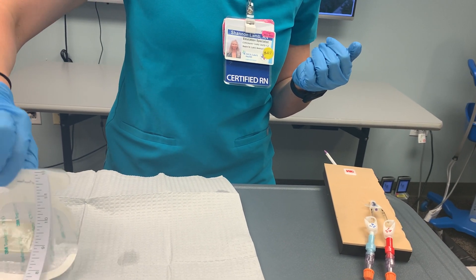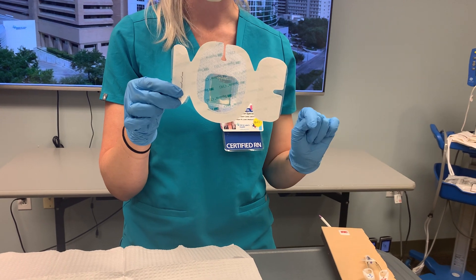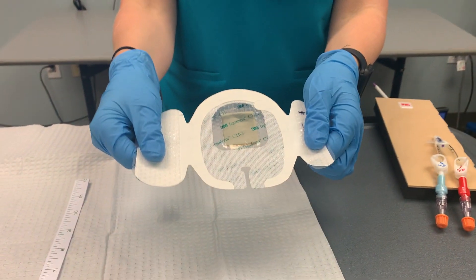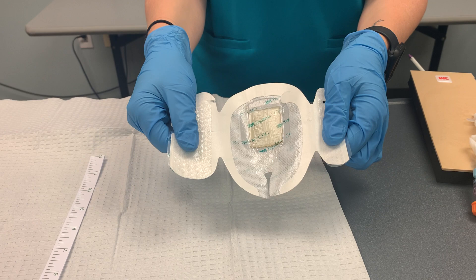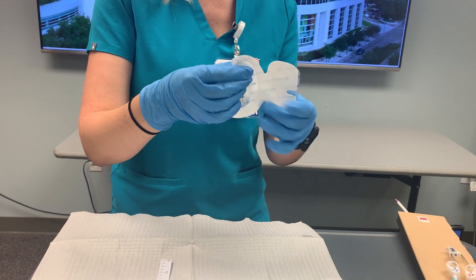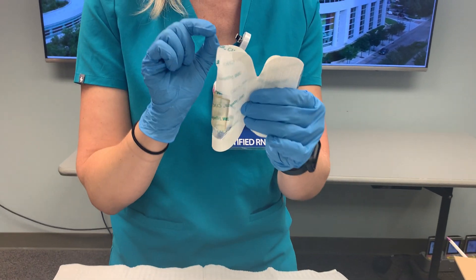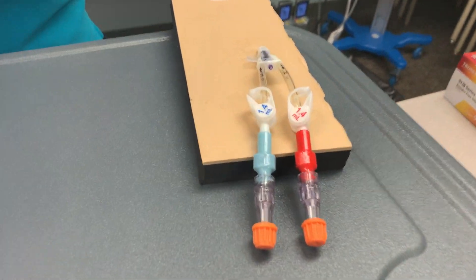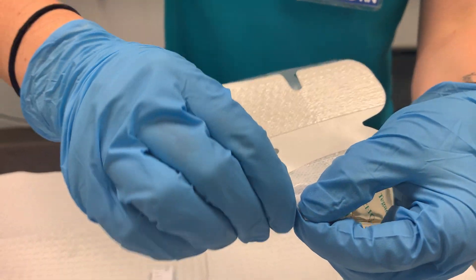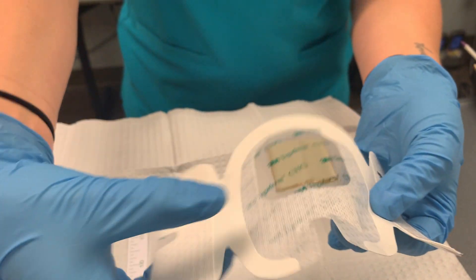Our last step is to apply our dressing. We want to make sure that the chlorhexidine patch is placed right at the insertion site, that there are no wrinkles in the dressing, and when we place it down we don't want to stretch the dressing out, because when it recoils it can cause skin breakdown and the edges can peel up. These chlorhexidine dressings will actually expand at the insertion site if we tear the perforation there. I have a dialysis catheter here — it's a pretty large lumen catheter — and if I want to accommodate for that large lumen, I can just use these little perforations to make the opening a lot wider, which will help the dressing adhere better and stay on.